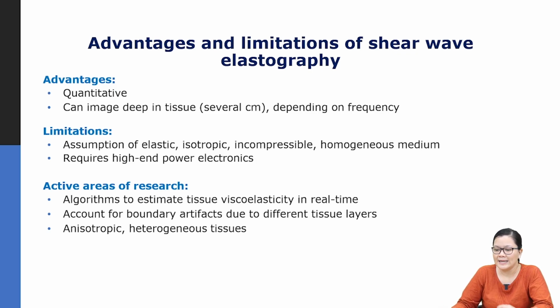Elastography also requires high-end power electronics. So specialized systems are needed to be able to produce this RF to excite the tissue and generate shear waves. There are some limitations based on accessibility due to this high-end power electronics. Nonetheless, there are efforts on trying to make this system affordable.